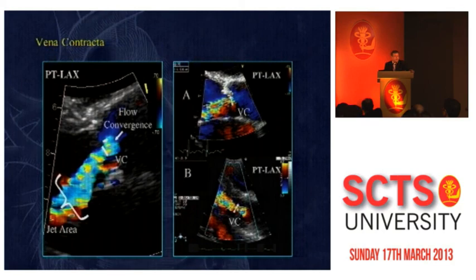This is simply a limitation of the echo machines, but we will use that limitation to be able to quantitate the volumetric flow rate across the valve. And how do we do that? Well, I cannot read the exact number here, but let's suppose it's something like 30 or 40 centimeters per second. So to do that, I will change the baseline so that we have the color in aortic regurgitation, in this case only, it's an apical view, only in blue.